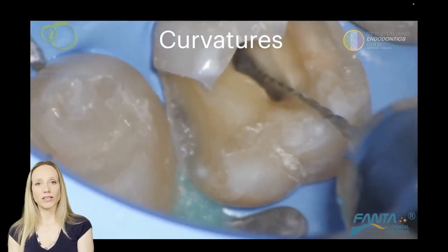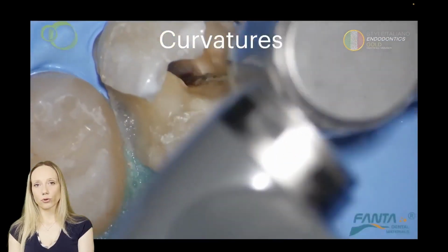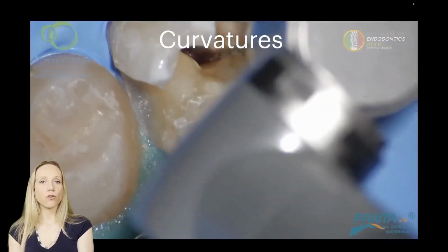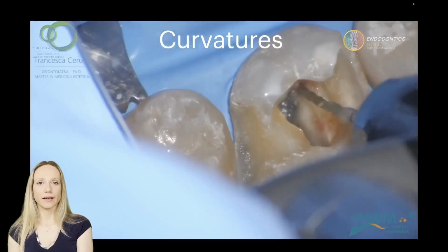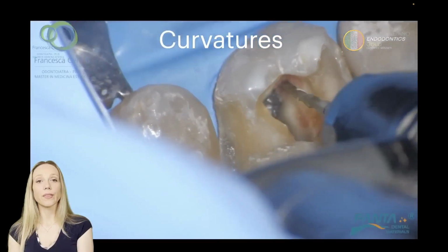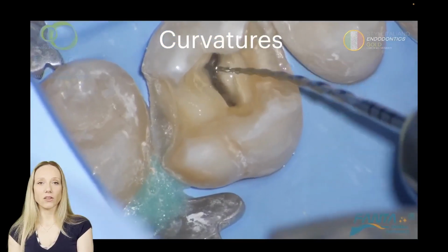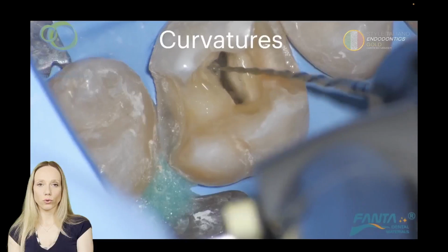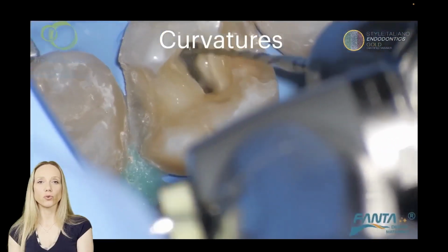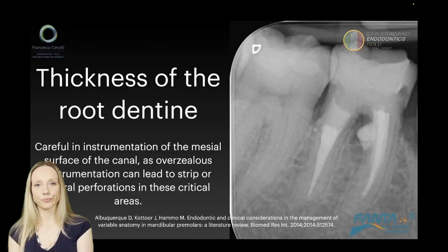The best that you can do is to make multiple approaches with 4 or 5 strokes and then remove the file, clean the spires and go again. And as I said before, pre-flare, remove the coronal interferences, then use a small file and go to the working length. After you have reached the working length with a small file, you can pass to a larger file.